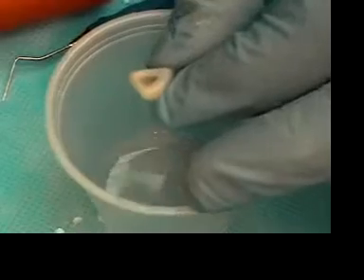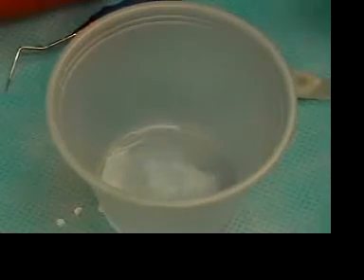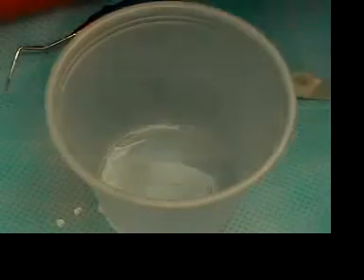So the way this is developed, I'm going to use the 30 as my master apical file. So now I'm going to go through my serial step back reaming and cleaning and shaping.